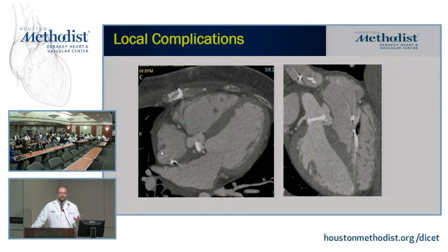The only caveat is, if it's a communication between the left side and right side, we usually have saline on the right side, and then we can see if there is some contrast going to the other side. Right, so the negative and positive contrast issues are important in terms of being able to see things, that's true. But for example here, you can see that there is equal contrast on both sides. So your point is well taken.